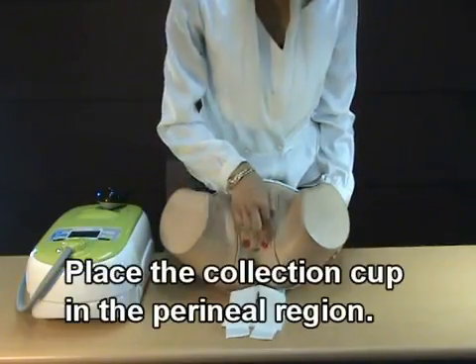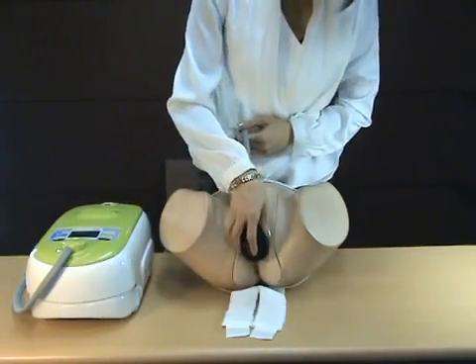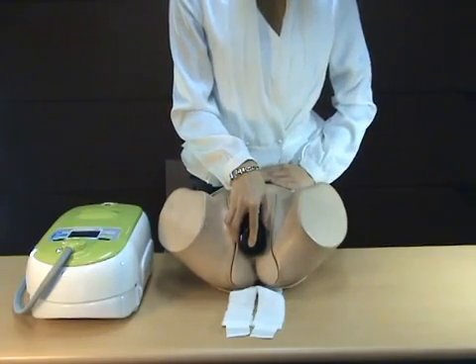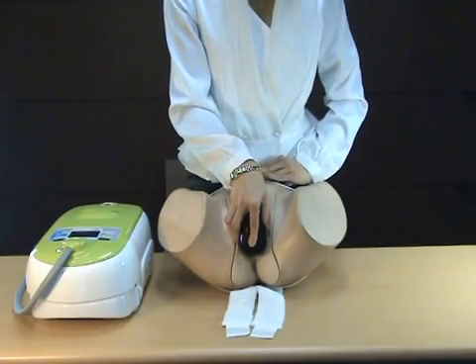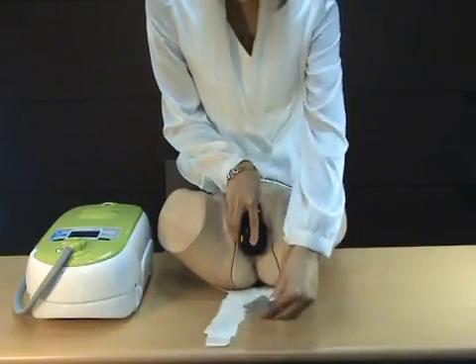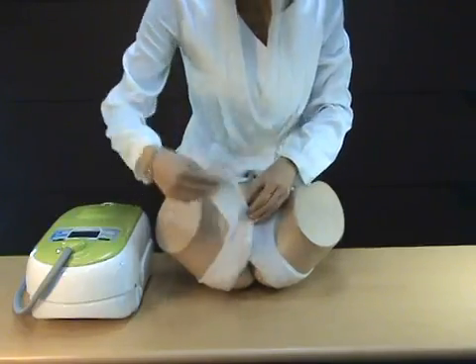Place the collection cup in the perineal region. Using the remaining short side of the elastic strap, affix the collection cup.